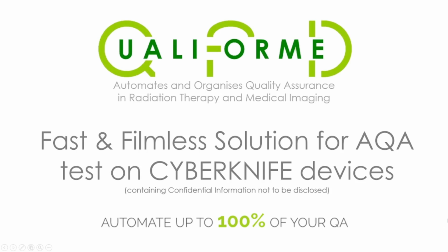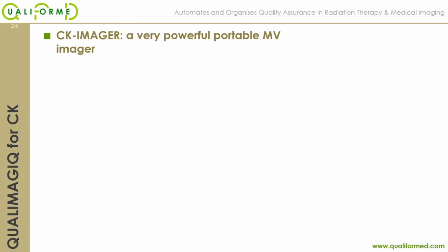Good afternoon and welcome. Today, I will present our solution to automate your AQA tests on your CyberKnife devices.